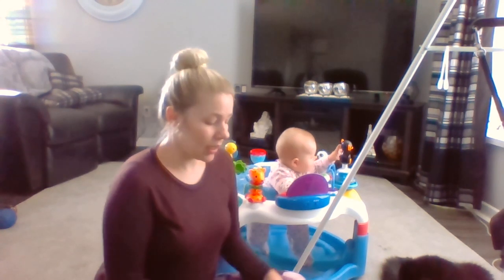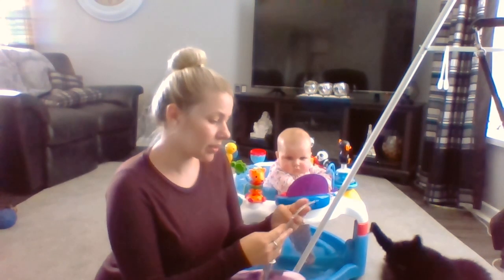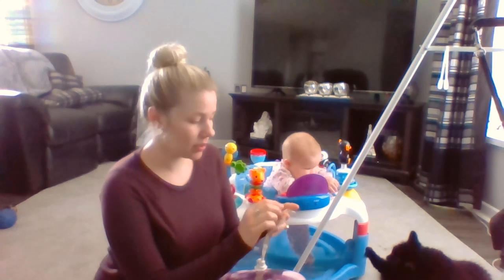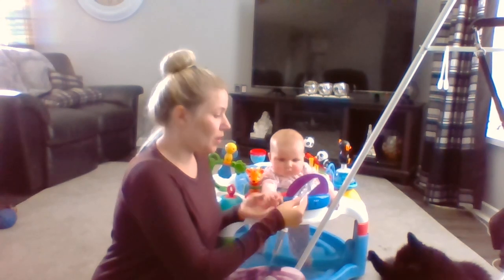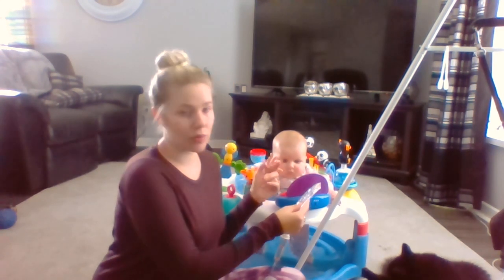The first check would be when I get the medication out of the patient's drawer, to make sure that I have the proper medication. The second one would be at the computer against the MAR: 500 milliliters of normal saline to be infused over 4 hours. And then the third check would be at the bedside beside the patient: Sloan Smith, normal saline, 500 milliliters to be infused over 4 hours.